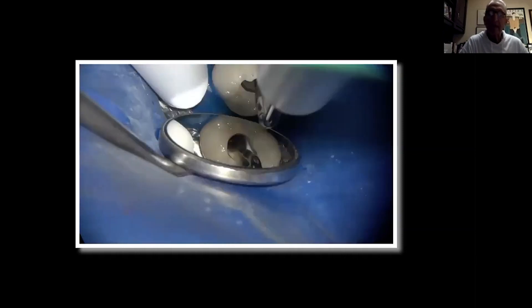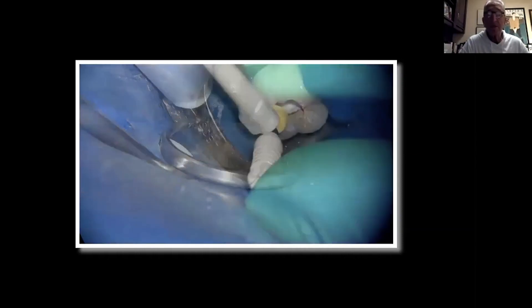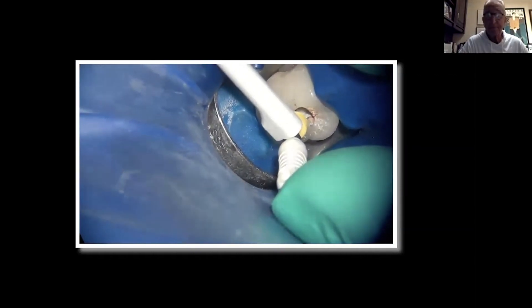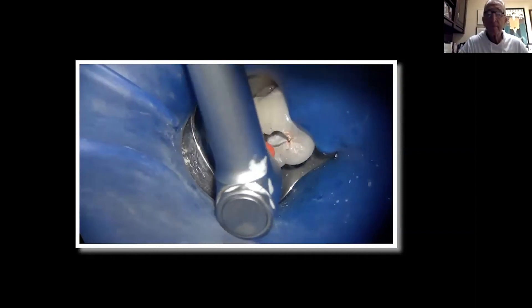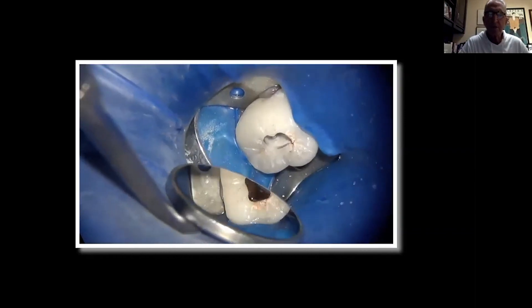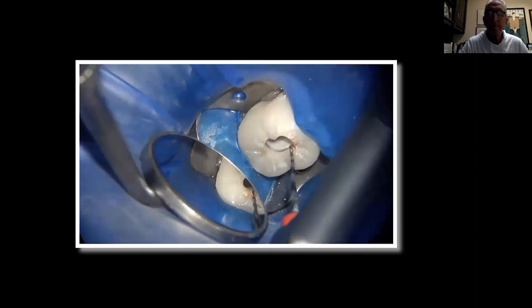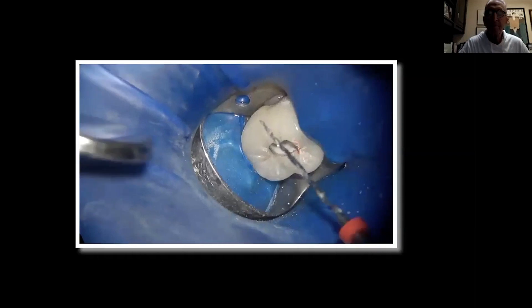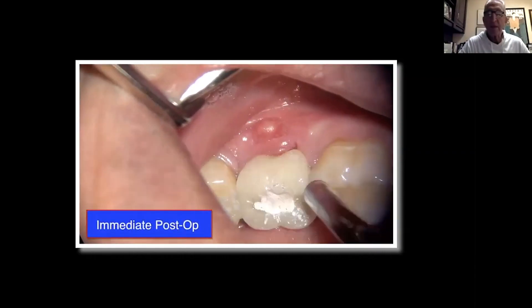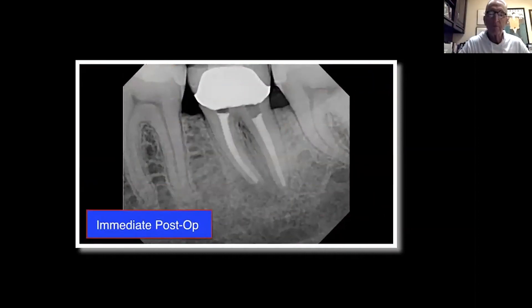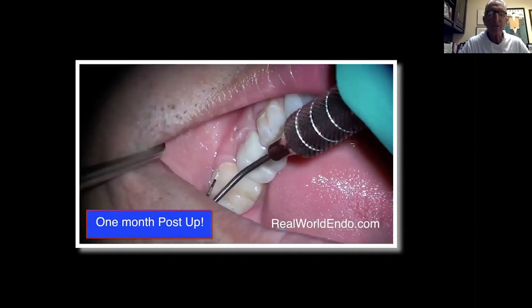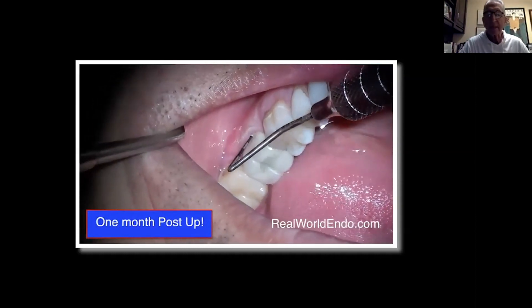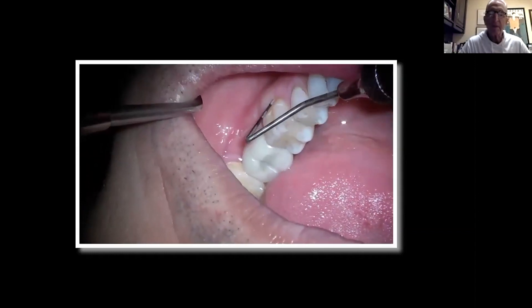Now Ali is going to take out the gutta-percha and then instrument and re-obturate. This particular tooth has a sinus tract, but no problem — that's the retreatment radiograph, immediately post-op. The sinus tract is completely healed one month later, everything is great, the crown is totally intact, and it's basically almost a routine retreatment.